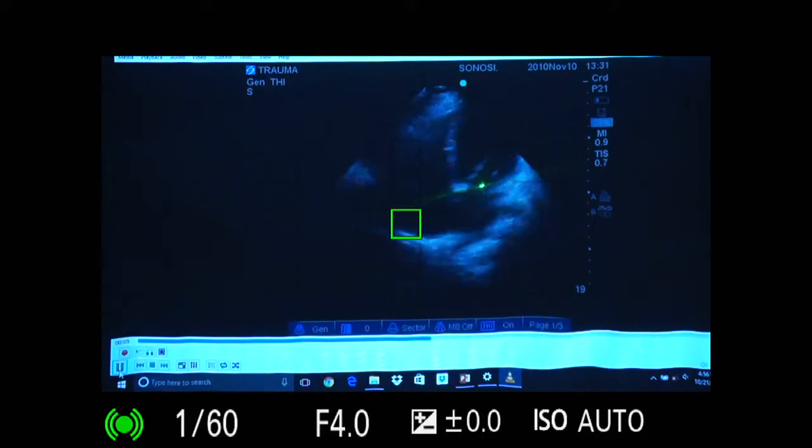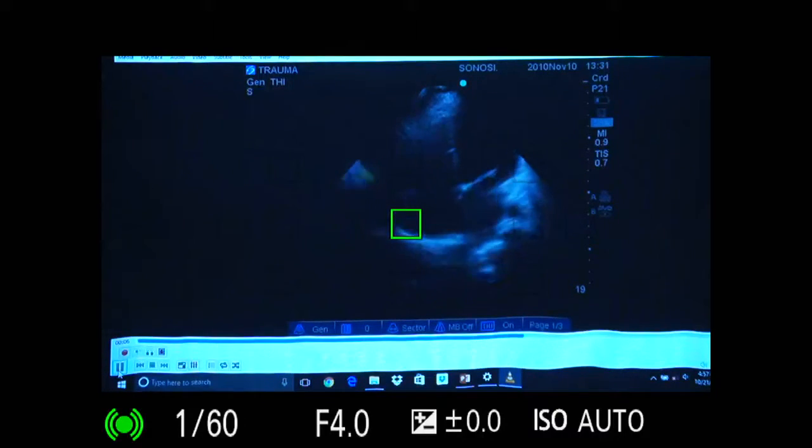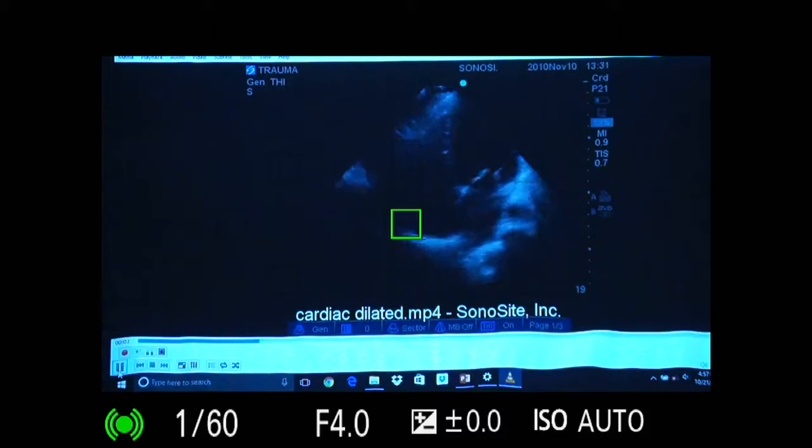Second observation is, you see the anterior mitral leaflet, can you appreciate? It should touch the septum so that you can say it is a good ejection fraction. See, hardly it is coming here, it is just flickering here. You understand? These are two points to say that this patient has a poor ejection fraction. This is a cause of arrest, okay.